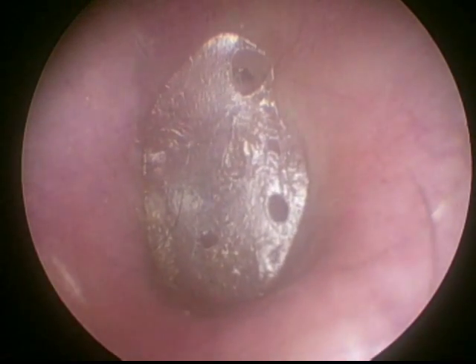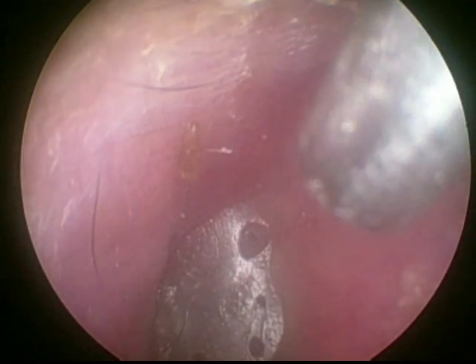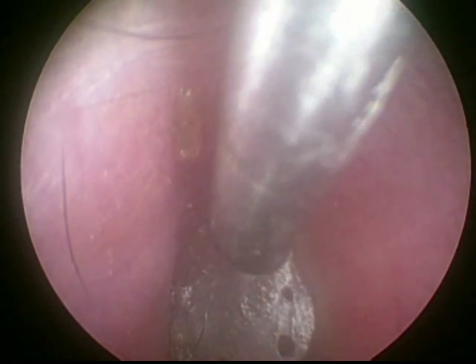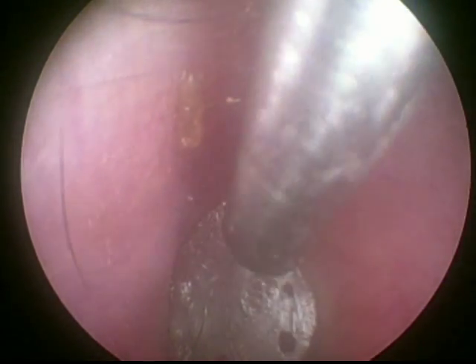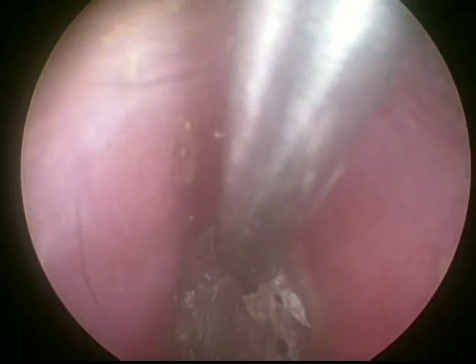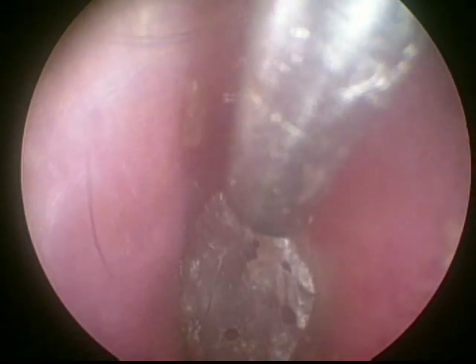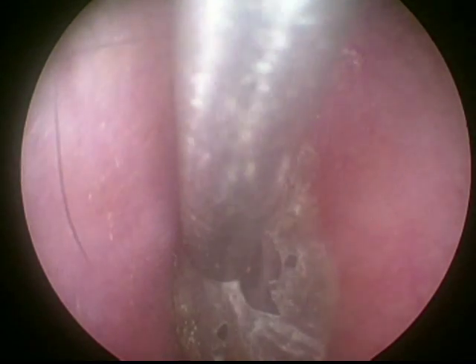Here you can watch the typical squamous epithelium in the form of a cast which is migrating laterally. There is some conductive hearing loss due to this squamous membrane — you can watch it, it's just like a pseudo tympanic membrane.